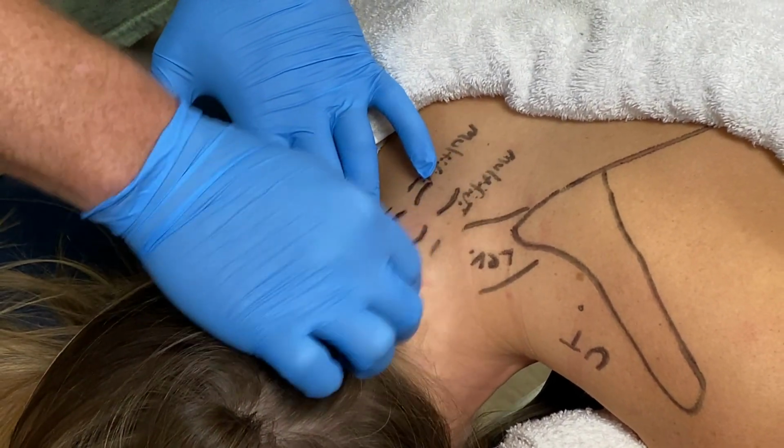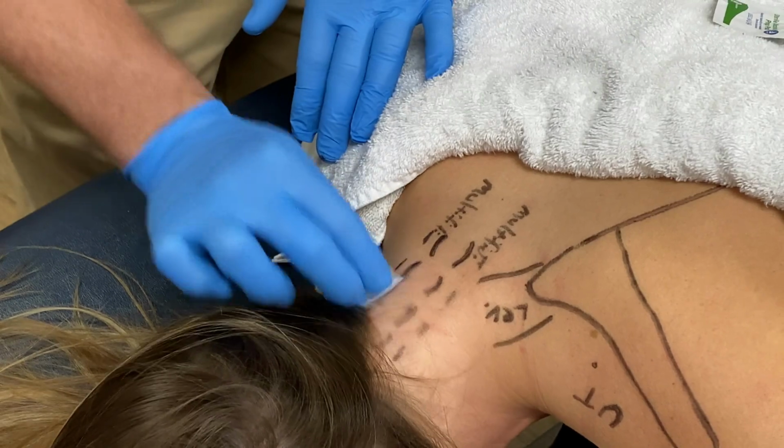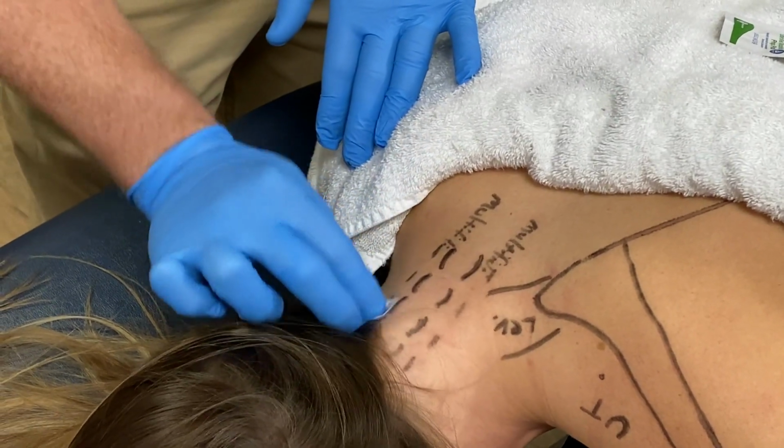As always, you'll maintain a clean technique by using gloves and performing an alcohol wipe down to all of the areas that you're going to insert a needle.